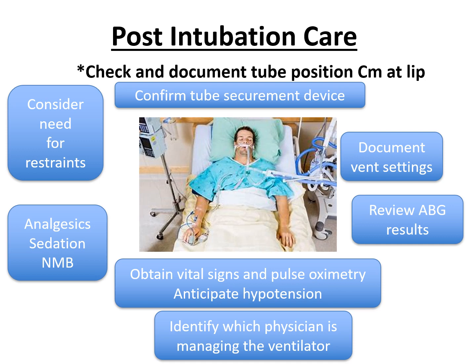You also want to note the patient's decreased work of breathing and any kind of medication effects, and consider the need for restraints. Most patients who are hypoxic are oftentimes restless and they don't really know what's going on, and they will reach and try to pull out the endotracheal tube. If you've gotten your patient adequately sedated, they should be okay. But again, if you are concerned that the patient is going to pull out their endotracheal tube, use restraints.